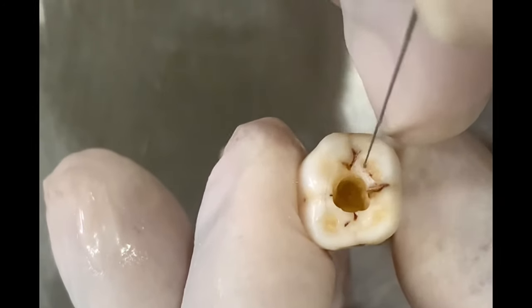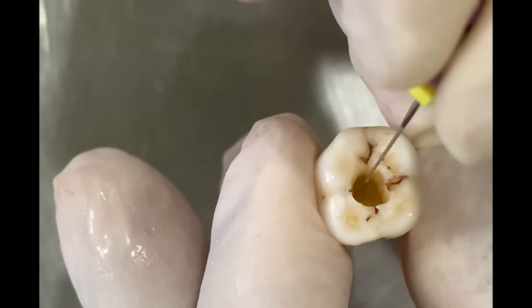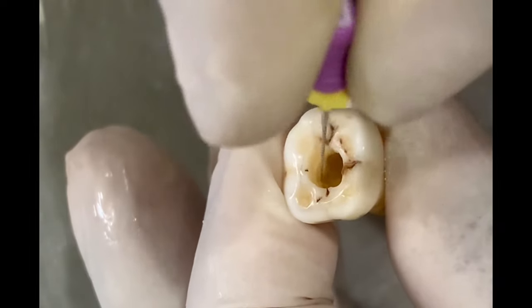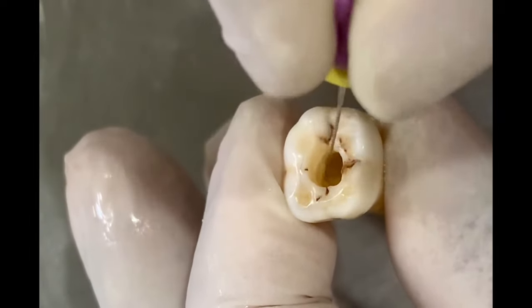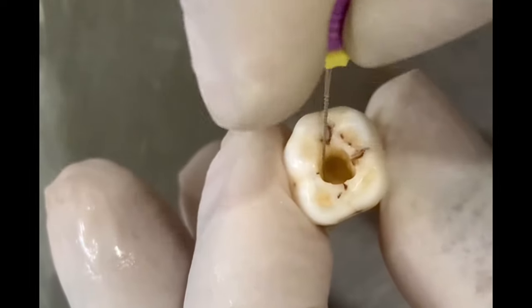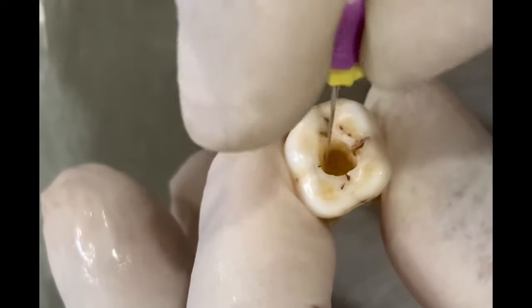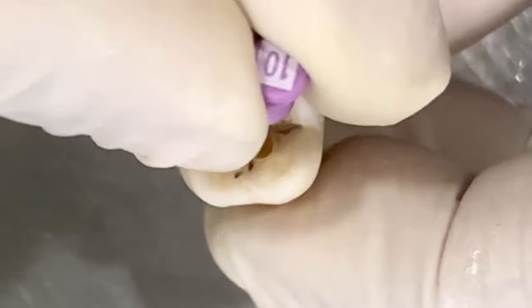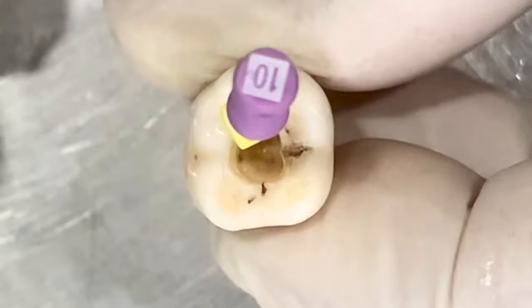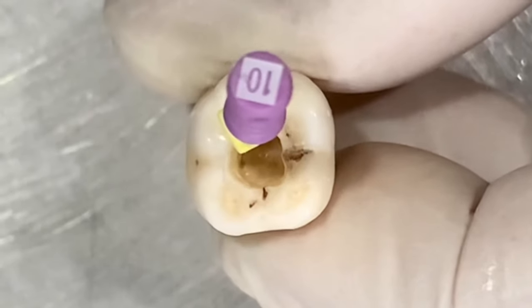I'm going to use a size 10 file to enter again into the mesiobuccal orifice. I am using glide because the orifice I felt was tight and calcified, so with the help of glide I will be easily able to enter. Now you can see we have easily entered into the mesiobuccal canal.